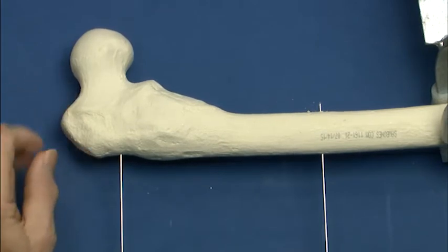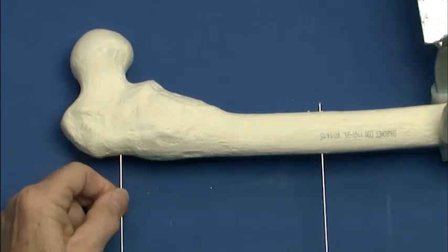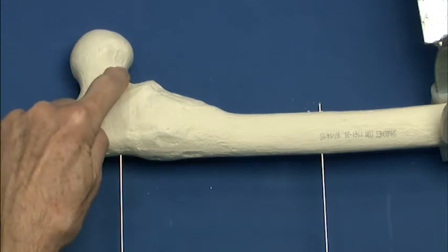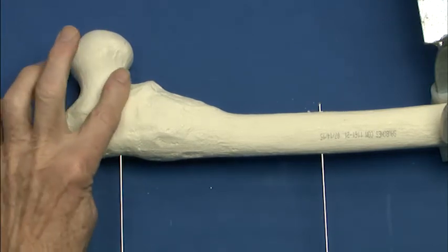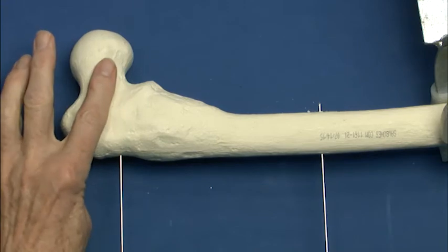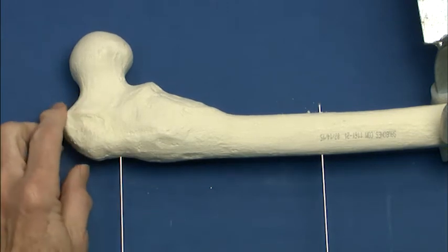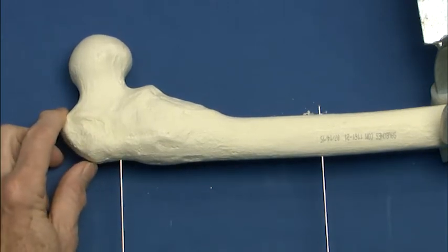So I think it's really important in these models that you try to, in the proximal segment, get some of this perimeter plastic, because there's virtually no bone in the neck. And if you're using it as a reference, you'll be able to push it anywhere you want. This is clearly not the case, and even osteoporotic bone has much better purchase.